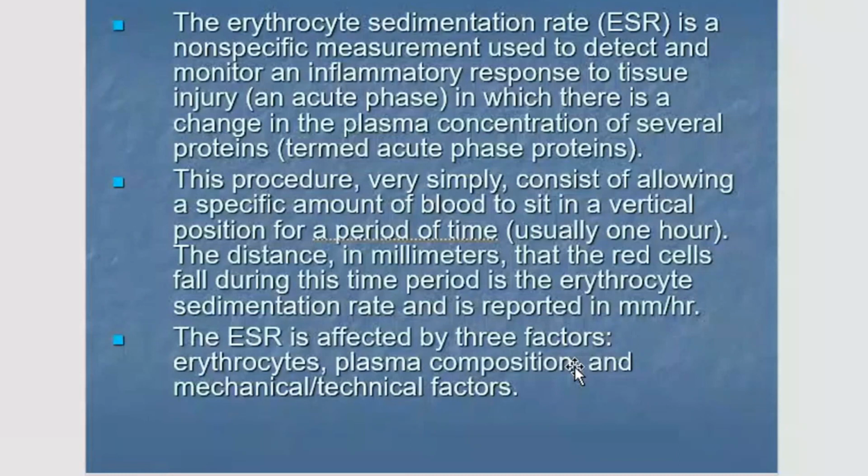What you have to do is you just collect the blood, and then the collected blood will be placed in the tube, and that will be placed in a vertical manner. That means we are keeping it in a stand, then we'll keep it for some time. Then automatically the red blood cells will get settled down. That means they will get sedimented. Then the remaining serum you can see.